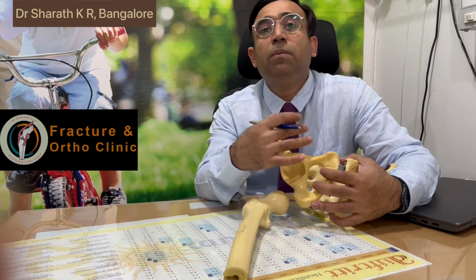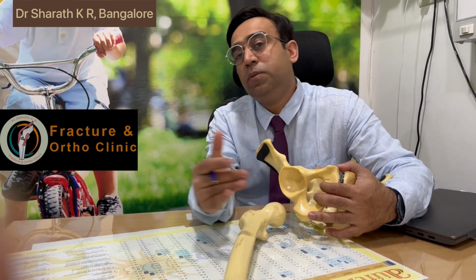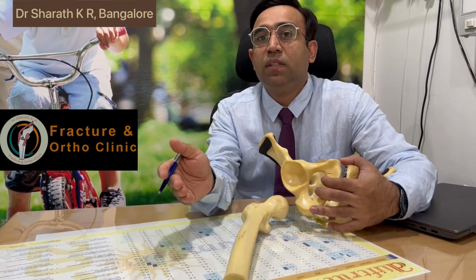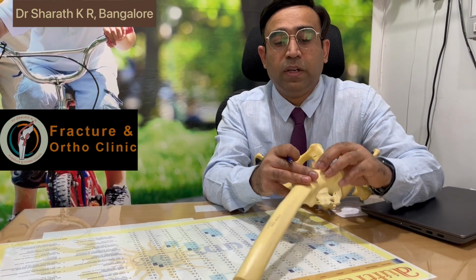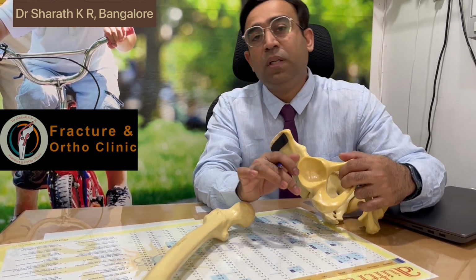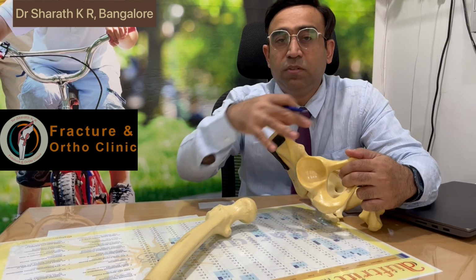Then how is this hip joint replacement surgery after post-acetabulum surgery different from normal hip joint replacement surgery, which we do for other reasons like avascular necrosis or fracture of the neck of the femur, fracture of the ball? So how is this different? We have to look into multiple angles. One is that there will be multiple scars, front and back, because of previous surgery.